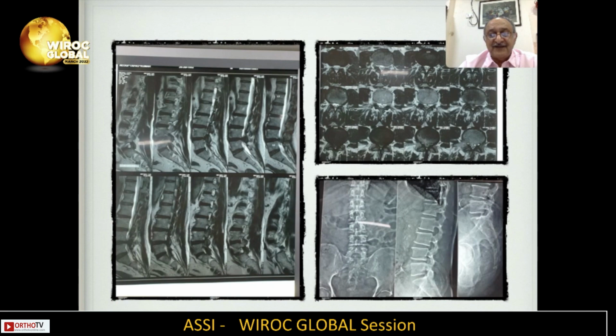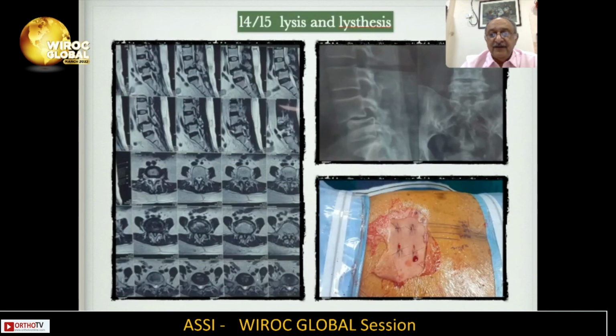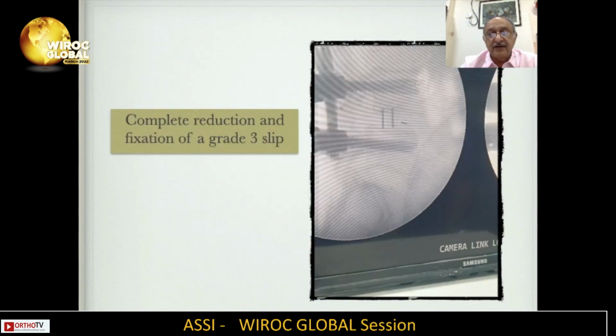And this is a case of stenosis, severe stenosis with instability and UBE fixation being carried out. This is again a case of listhesis, degenerative listhesis. And you can see how fixation has been carried out over here.